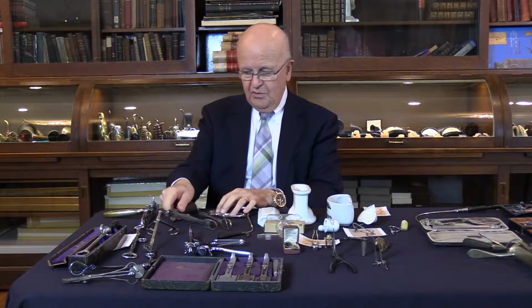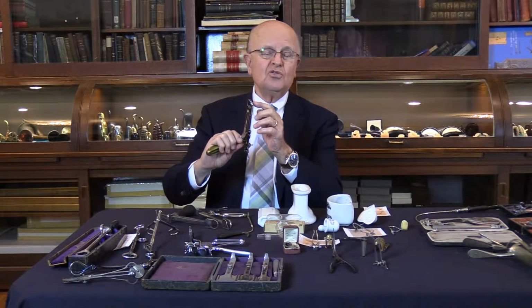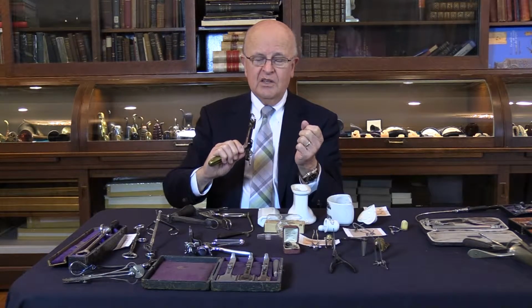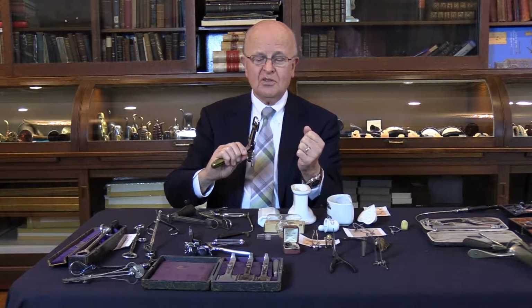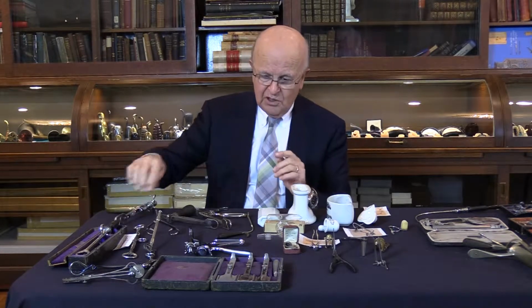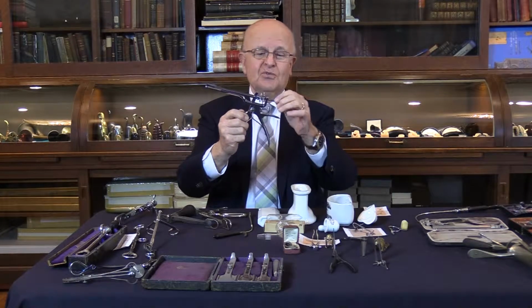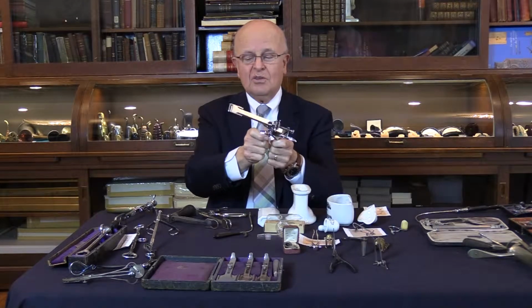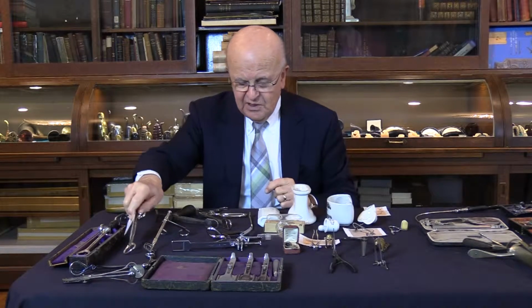The big problem that they had at that time is that they used to do tonsillectomy under local anesthesia, and there were many incidents of the patient swallowing his or her tonsil. So they came up with something to complement this type of guillotine that I showed you before. There are some sophisticated, complicated types, but they are all the same principle. The guillotine will cut the tonsil off. So they came up with something that is very clever.